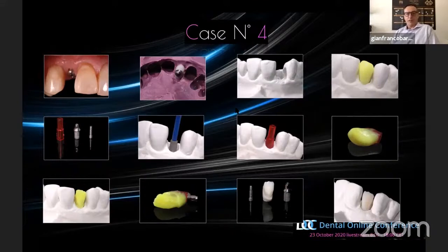It's a special kind of abutment created to give us the possibility to make a good result in easy time and with easy passages, with some features respected.